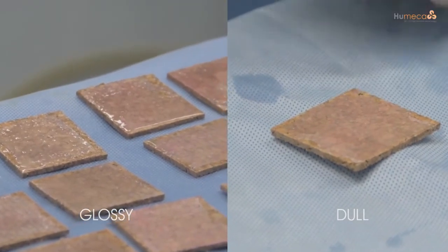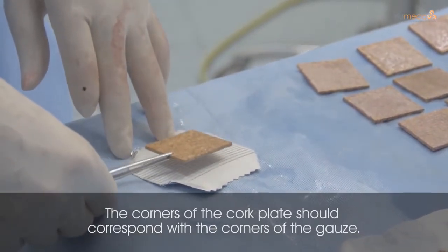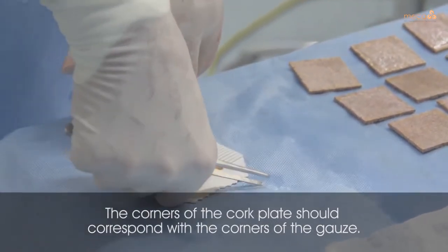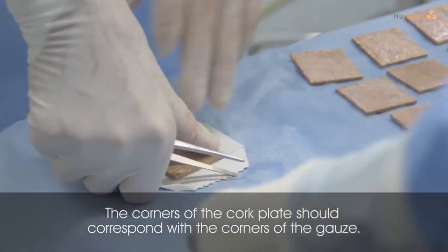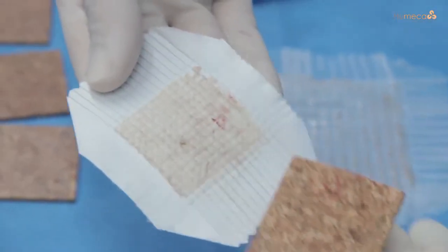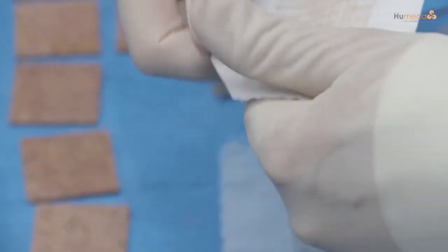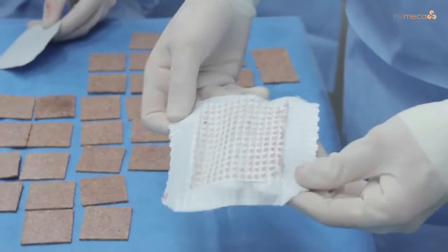Set a timer and make someone responsible for monitoring the time. After the required drying period, transfer the skin islands from the cork plate to the center of the sterile pre-folded gauze, making sure the cork is placed in the center. Press firmly with your thumbs and leave the cork plates in place until the moment of transplantation. For expansion, start at the zigzag side and stretch completely, then perform the second expansion on the plain side and stretch that completely as well.